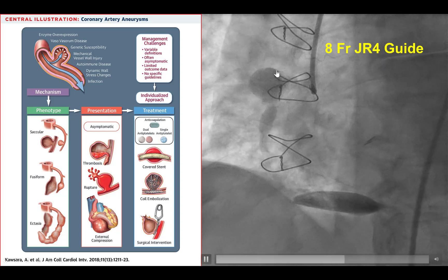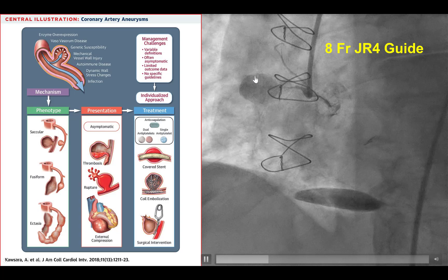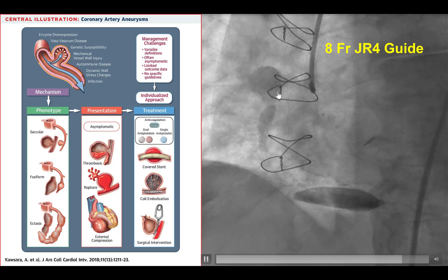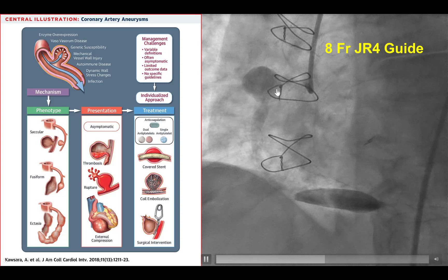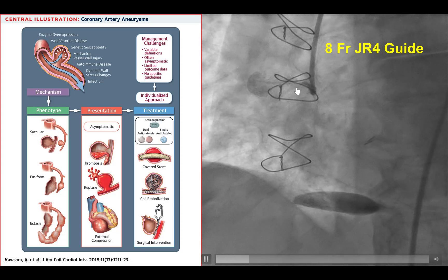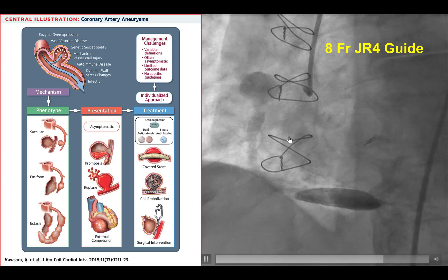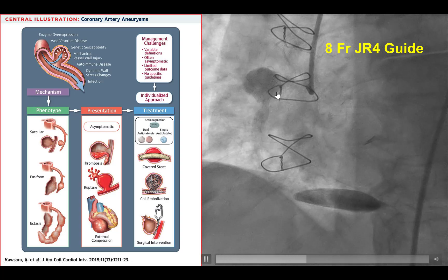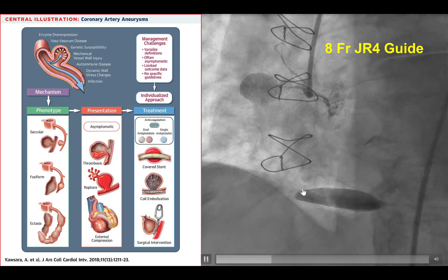When the vessels are particularly large, for example in the case of aneurysms — defined as the dimension of the artery more than 1.5 times the reference dimension — it can be very difficult to visualize the distal vessel because the contrast tends to hang out in the aneurysmal segment, providing poor visualization distally.